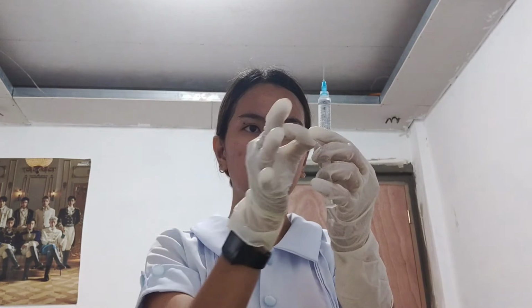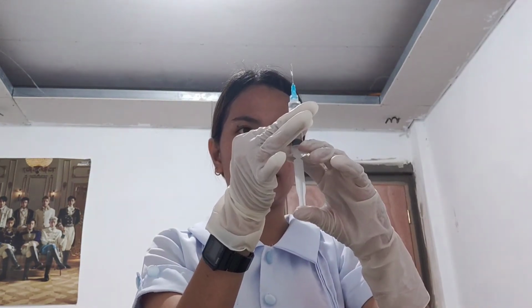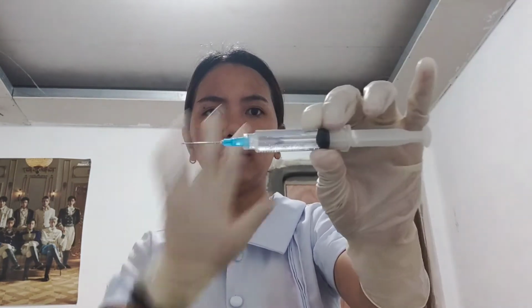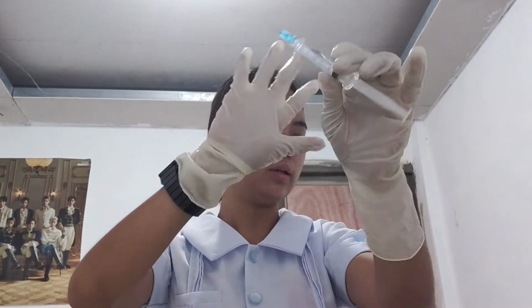If there's an air bubble, just stop and remove it. Okay, so that's it. There's no bubble in the syringe. Now we are done preparing the ampule.